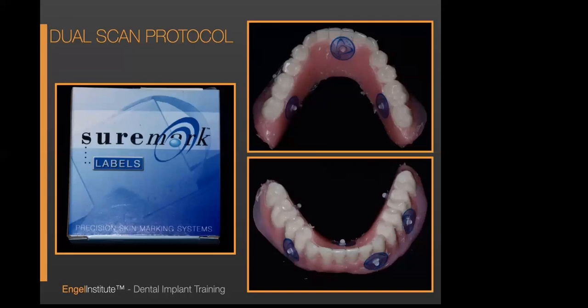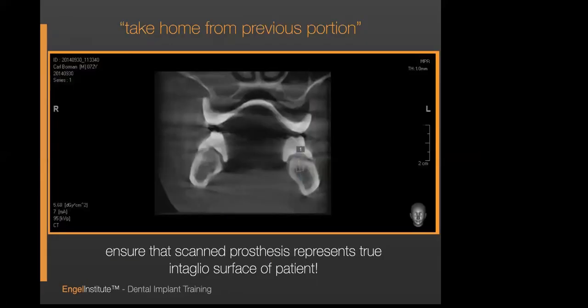As long as the teeth are secured in the rim, we're good with that. It doesn't have to be a fully processed denture. Okay, what is not a good denture? It is this that you're looking at.